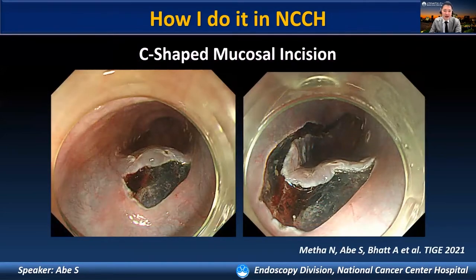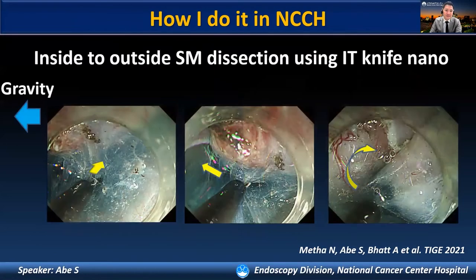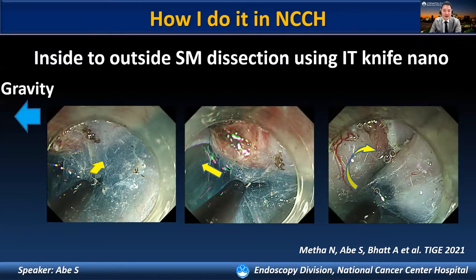In order to overcome this technical difficulty, we perform a C-shaped mucosal incision to maintain tissue traction towards the anti-gravity-dependent side. Also, when we perform submucosal dissection of the left side, we can safely dissect the submucosal by manipulating the IT knife nano from inside to outside.